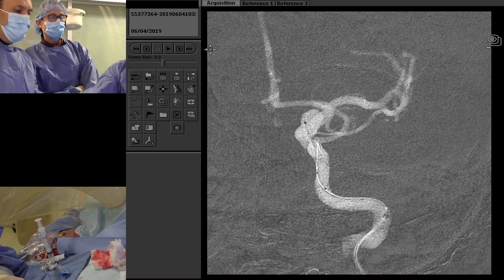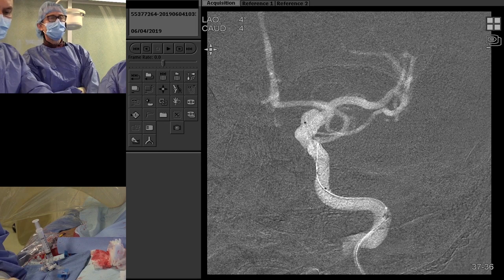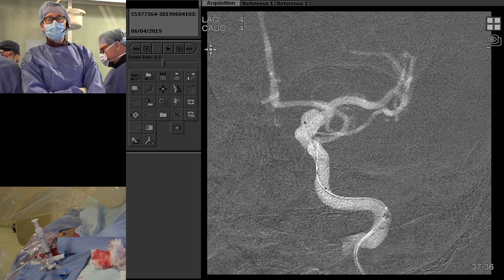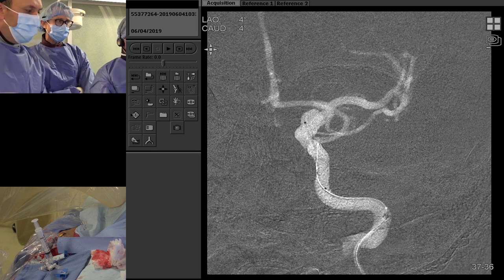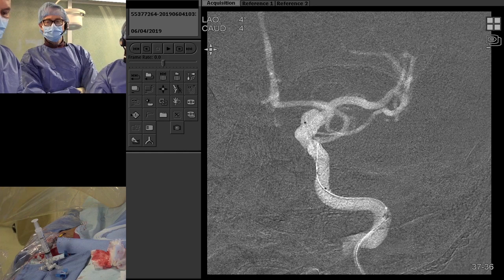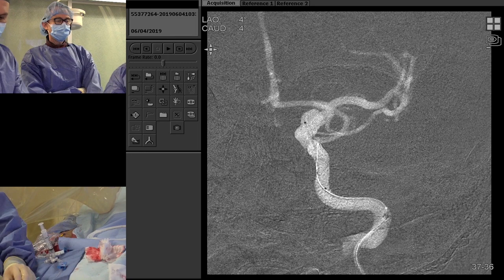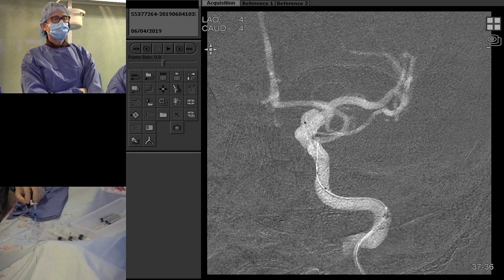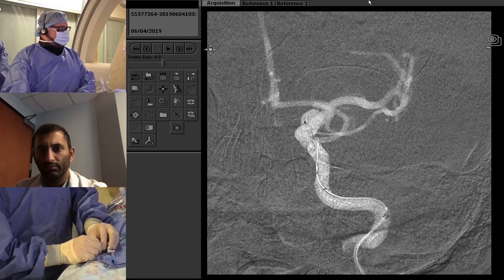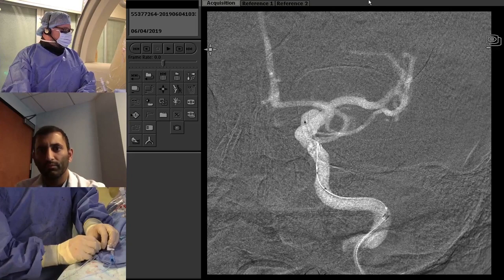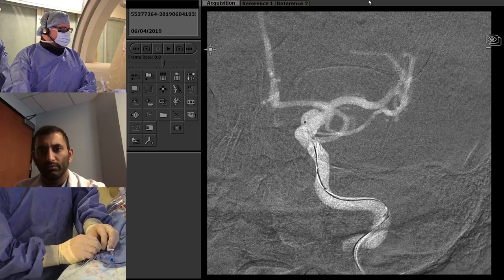There are different complex shapes available for the detachable coils. The first one is usually slightly stiffer — a complex shape that might form a ball, square, or cube to press against the aneurysm wall, creating a basket for the remaining filling coils to nest properly. In this case we've chosen a microsphere coil, which takes a very fixed boxy shape. We don't want it to find its way into the parent artery — just create a little thrombogenicity in the dome. For aneurysms about one centimeter or larger, there have been reports of delayed aneurysmal rupture after placing a flow diverter, so having a decent coil mass predisposes the aneurysm to thrombose more quickly.